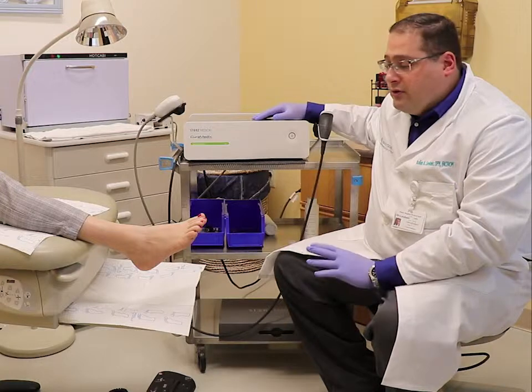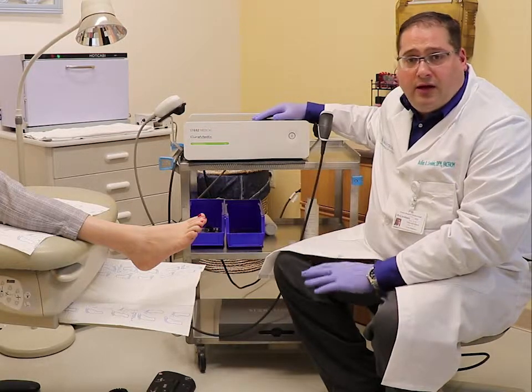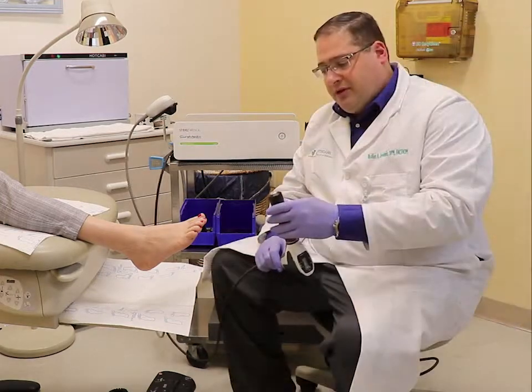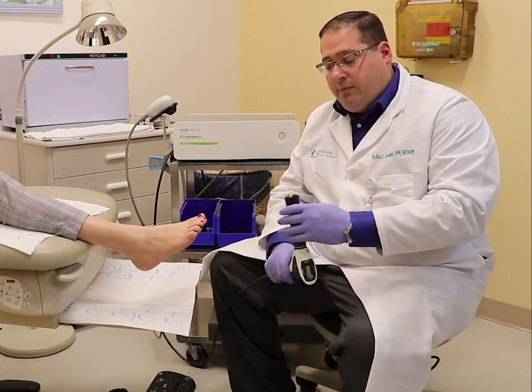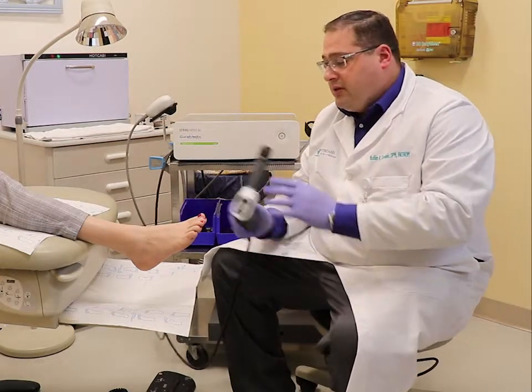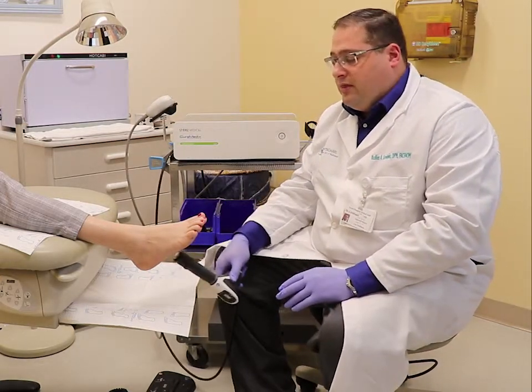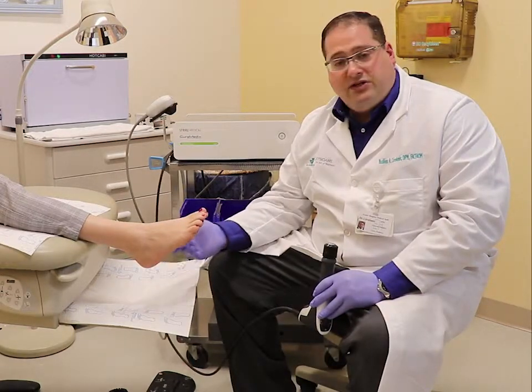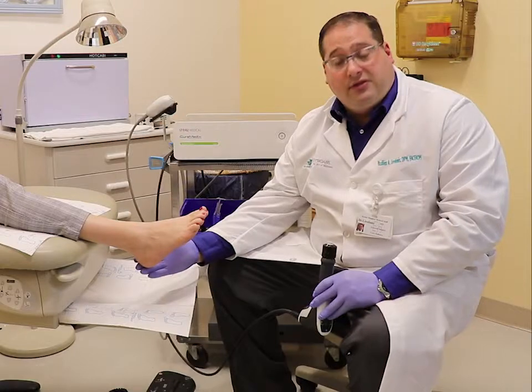As noted, we use this for plantar fasciitis as well as Achilles tendonitis. The treatment involves this applicator where I put gel on top of it — this regular ultrasound gel — and we apply this to the heel and then to the entire foot. We can either do it here for plantar fasciitis or the back of the heel for Achilles tendonitis.